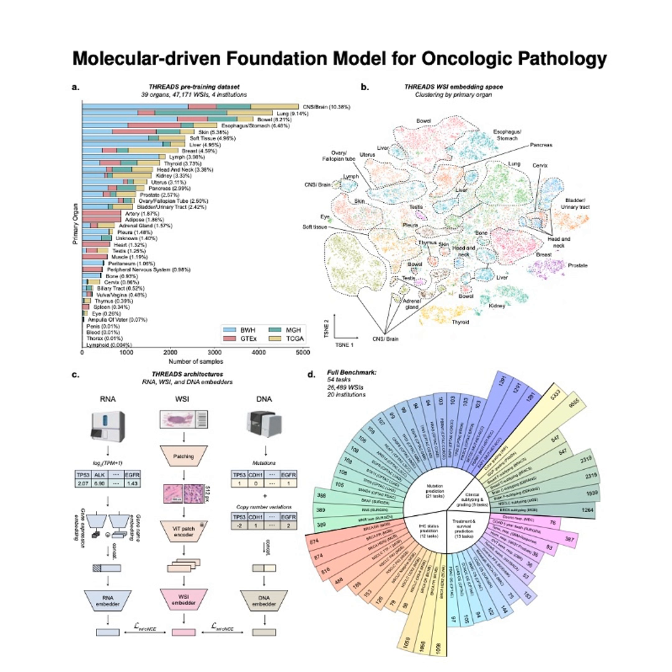Remember those prognostic and treatment prediction tasks? The ones in that 4th family. Yeah, the ones with tiny cohorts. Tiny cohorts, exactly. Often just 36 to maybe 144 patients. Threads showed superior performance in all 7 of the specific treatment prediction tasks they tested. All 7 examples. Yeah, things like predicting patient response to bevacizumab in ovarian cancer or to temozolomide in glioblastoma.